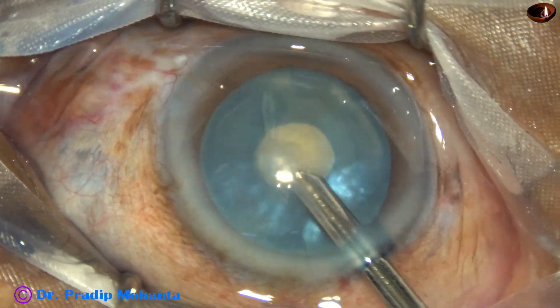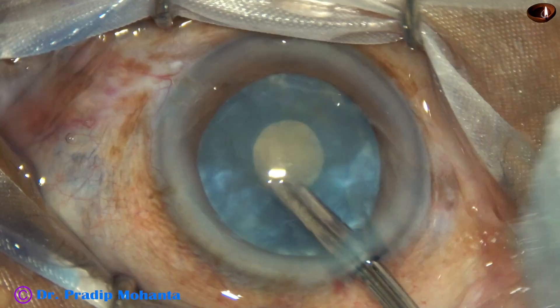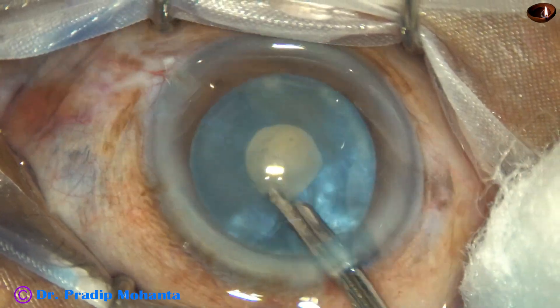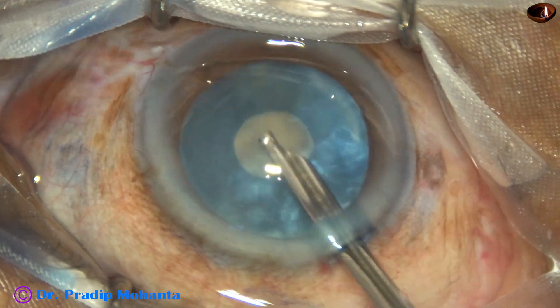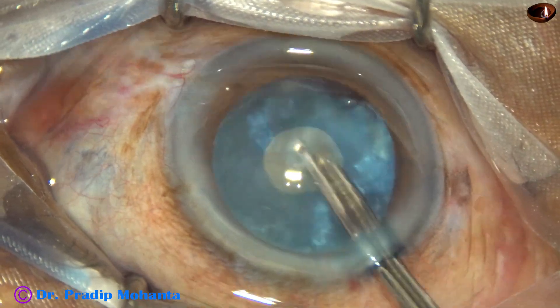The idea is to decompress the capsular bag. I aspirate a lot of cortex, tap on the nucleus so that cortex from behind comes anteriorly, and aspirate all the cortex. I try to rotate the nucleus, and most of the time it rotates.